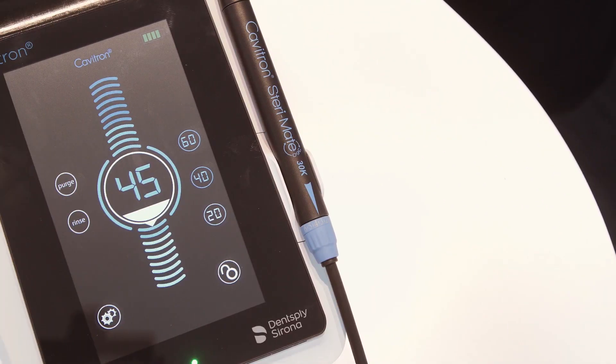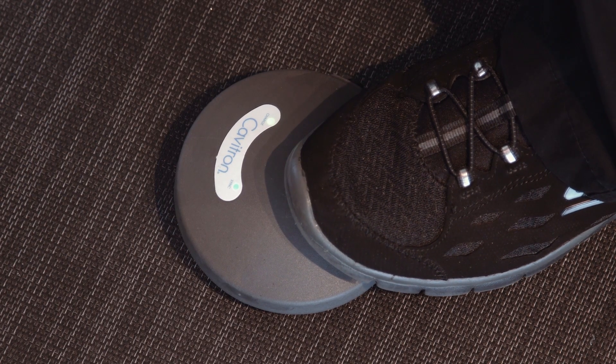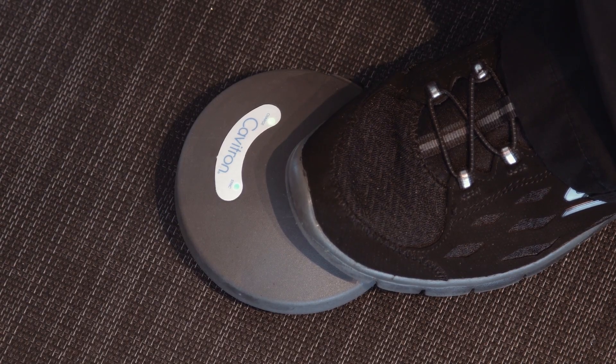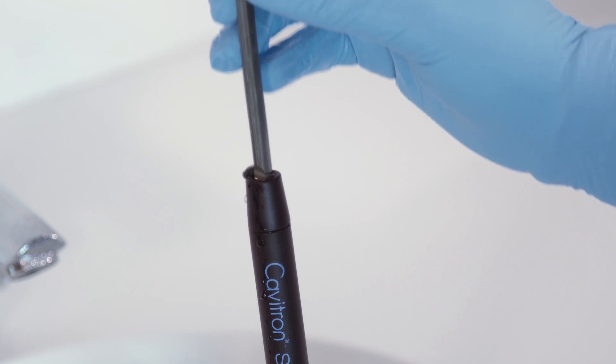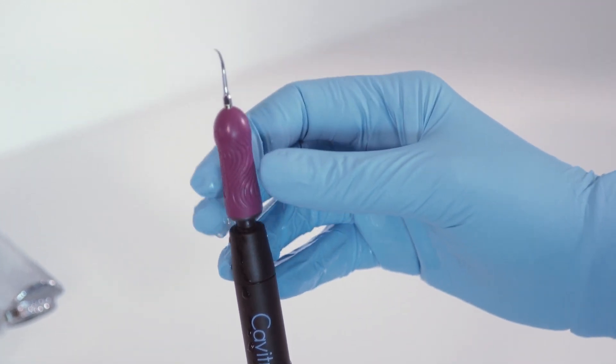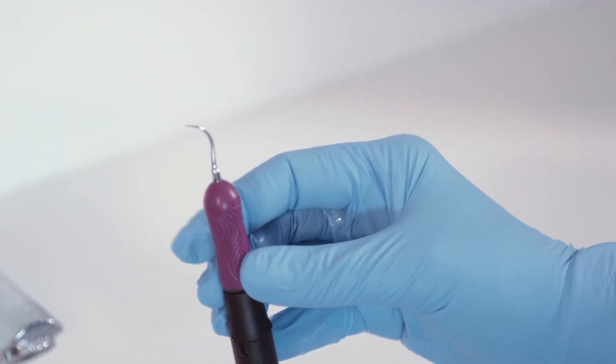Once the cord and handpiece are connected, depress the foot pedal until water exits to release any air bubbles that might be trapped inside the handpiece. In order to fully seat the insert, push with a gentle twisting motion. Do not force it.